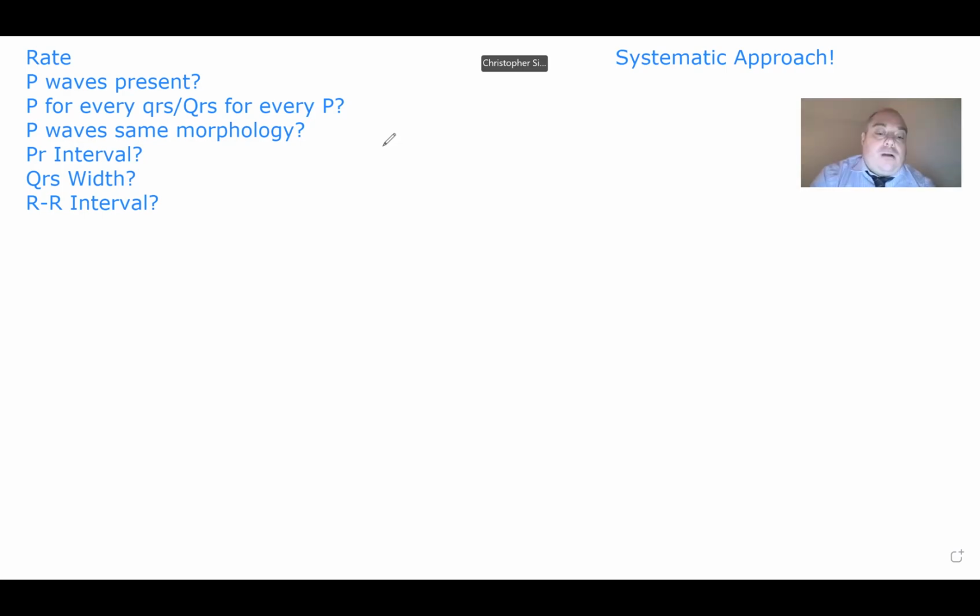So I'll tell you right now, once you've seen a bunch of sinus rhythms, once you've seen a bunch of normal stuff, you can just look at it and be like, yeah, it's normal, okay? But don't get in that habit, because when things get weird, which I promise you they do, and you look at it and go, oh my goodness, what is going on here? I have no idea what's happening. That's when you need to go back to your systematic approach and start asking yourself the questions, okay?